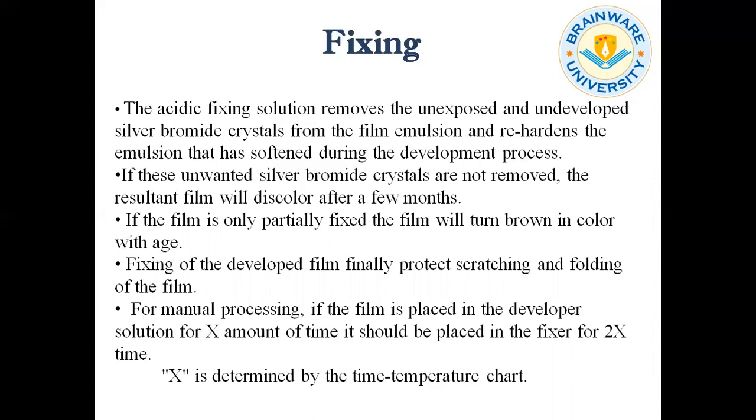That means the unexposed silver bromide crystals, or the undeveloped silver iodobromide crystals, should be removed during fixation. Otherwise, the film will be discolored after a few months.